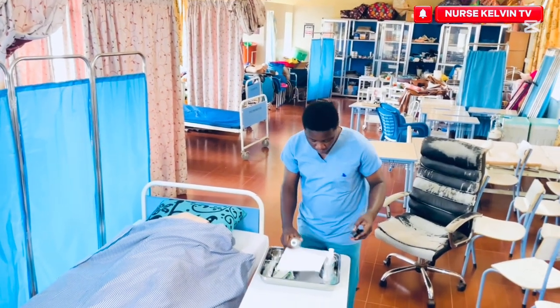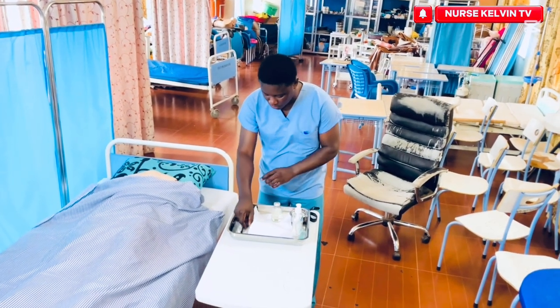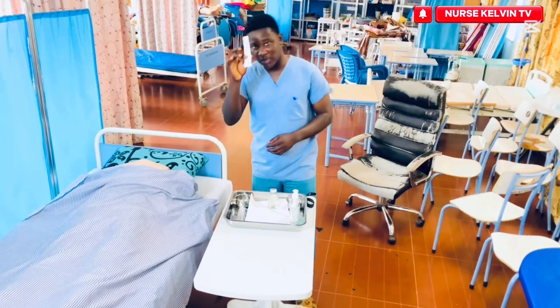Okay. So afterwards, then you will draw. So you take your syringe.